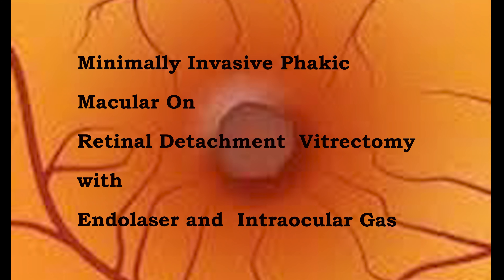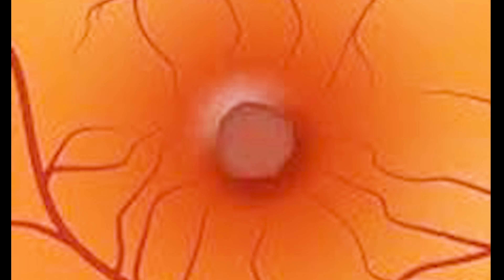This is Inverted Vitrectomy — minimally invasive phacic macular-on retinal detachment vitrectomy with endolaser and endotamponade gas.